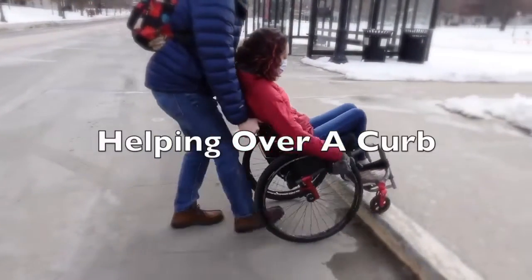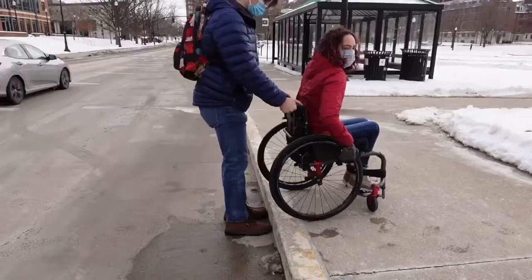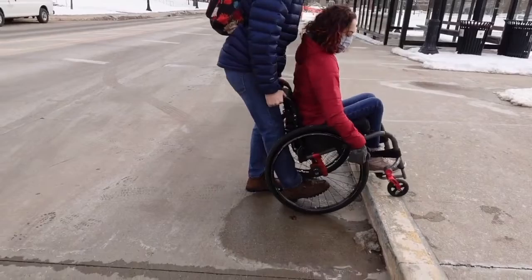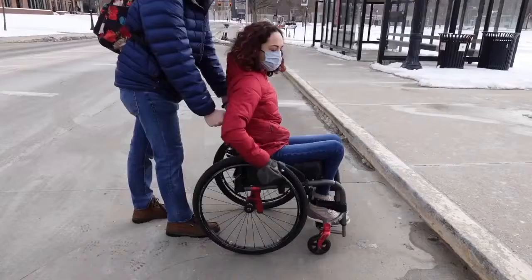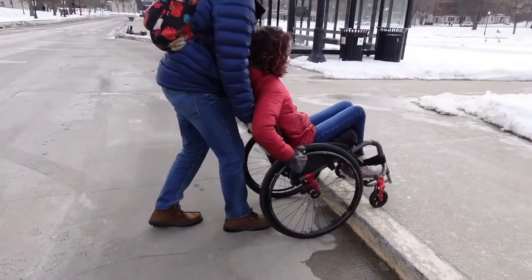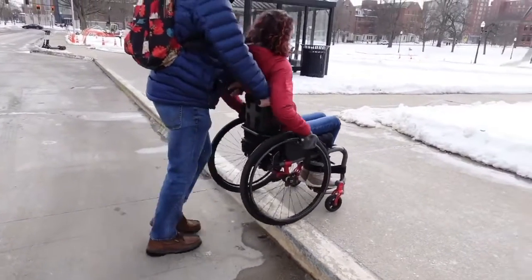The most important part of helping someone over a curb is to not jolt them suddenly out of their chair. So helping them down a curb, you want to make sure that you lower them down safely and pull them back slowly. And going up, make sure they are able to pop a wheelie before pushing them up over the curb.